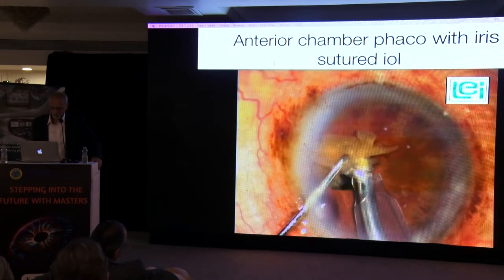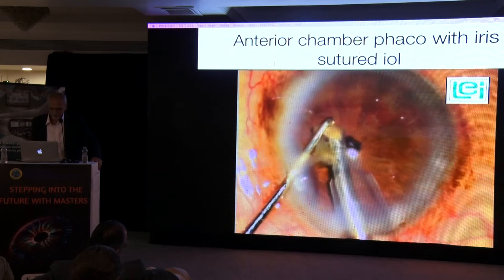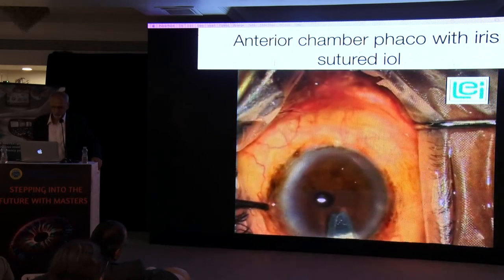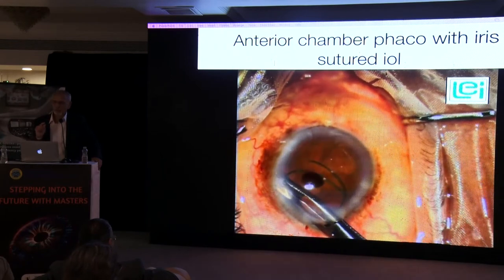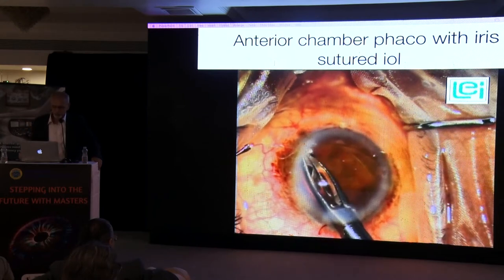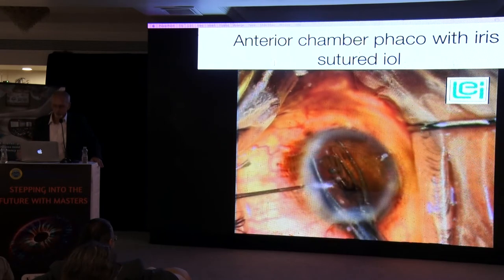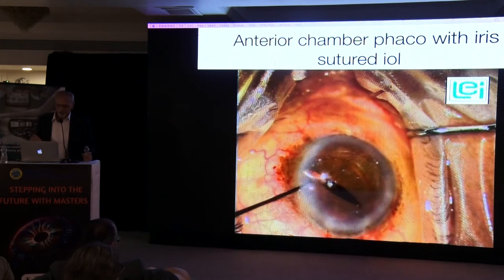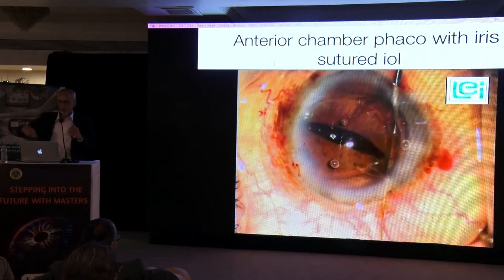Then obviously the question was, how are you going to manage the visual rehab? And then I tried one of my very favorite techniques, and that was suturing the three-piece lens onto the posterior surface. If you remember, in the earlier days, we used to have holder and folder method, and this is called bucket handle technique, in which you fold the lens and put those haptics behind the iris and just release it. Because of the size of the pupil, the optic stays above and the haptic goes behind, and automatically there's an optic capture. And that optic capture gives you that slit kind of a pupil to your advantage, because that is when you can suture that haptic onto the iris.